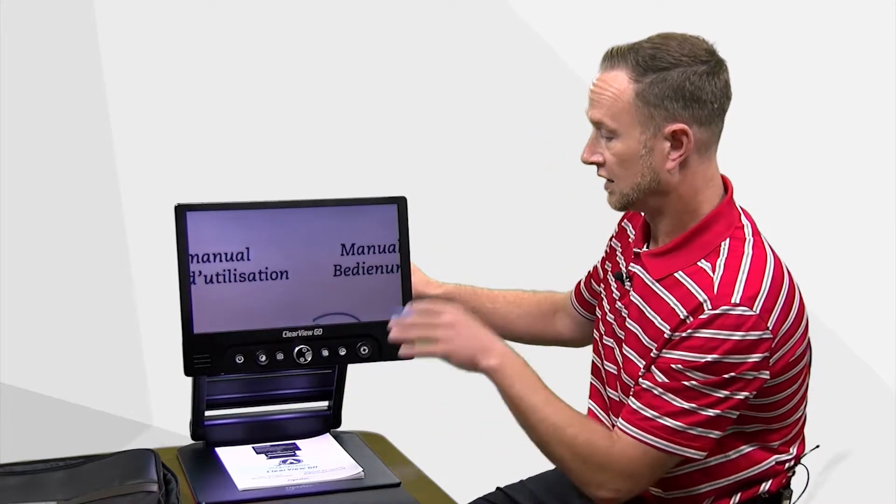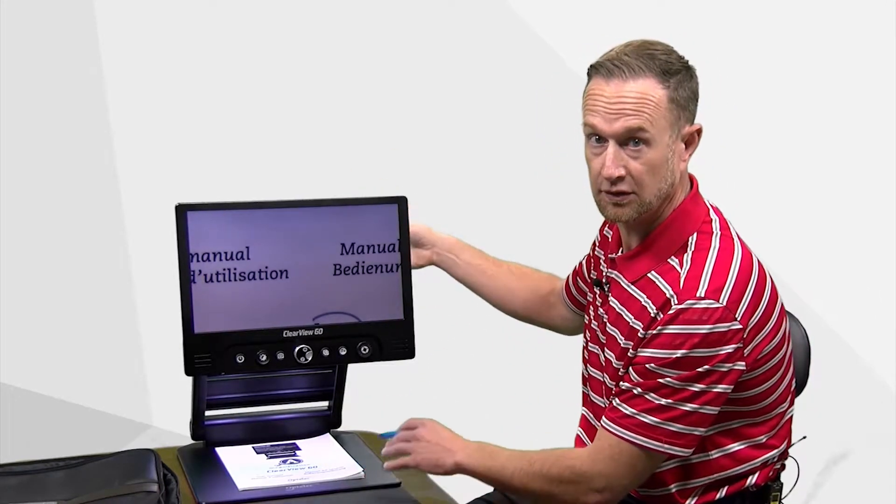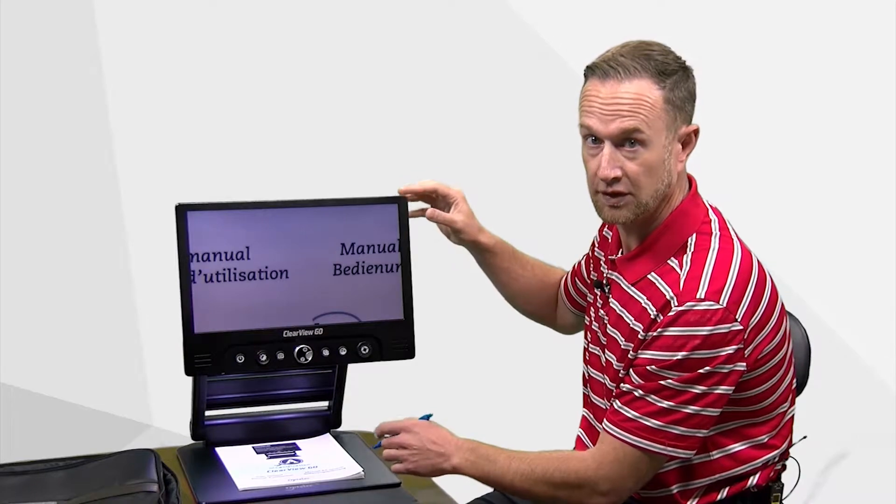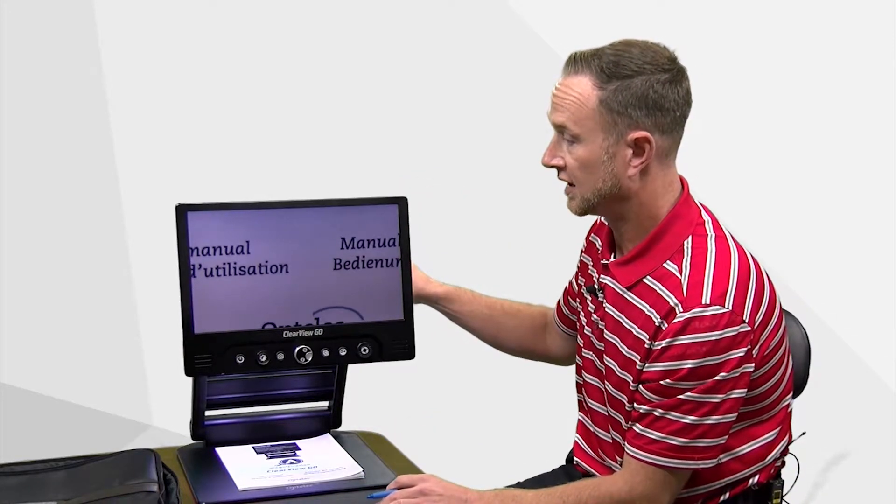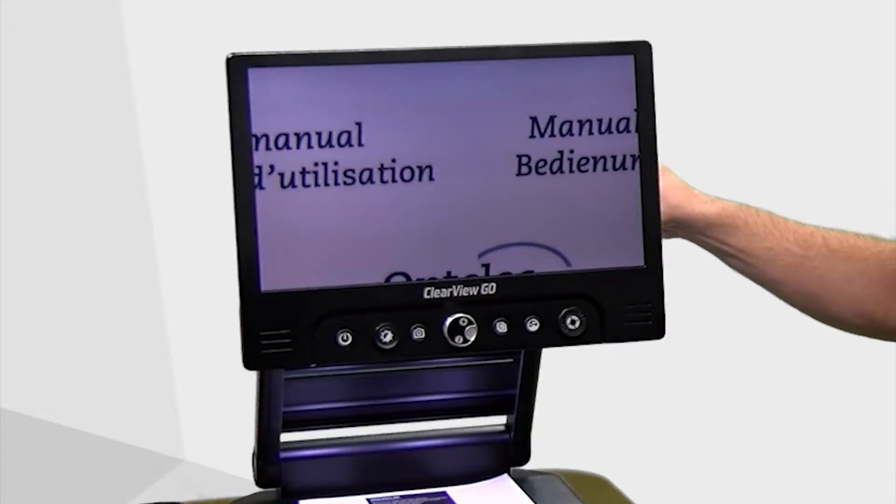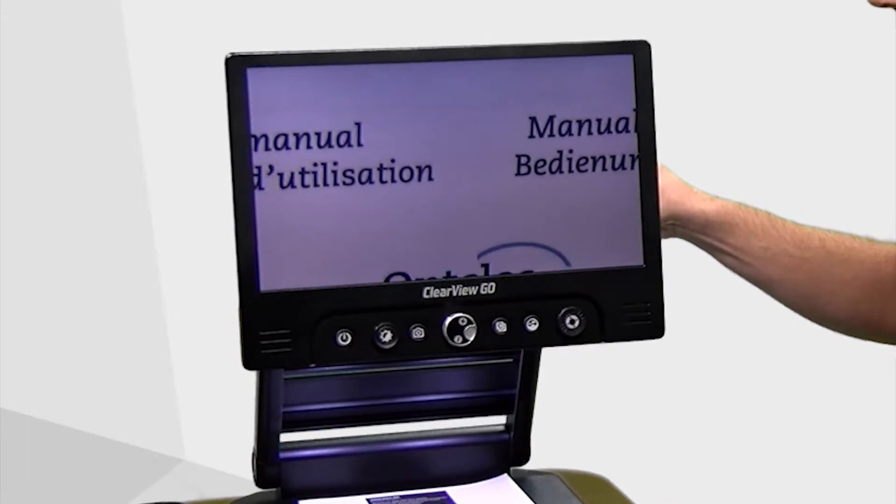So you have close viewing, distance viewing, self viewing, and a truly an image that's truly second to none in terms of the quality of it.